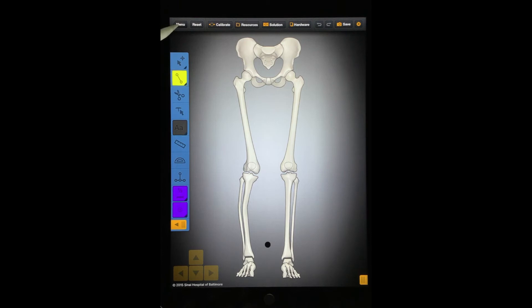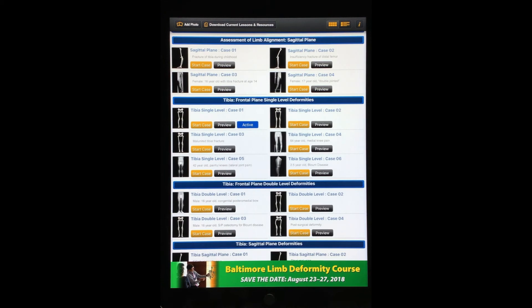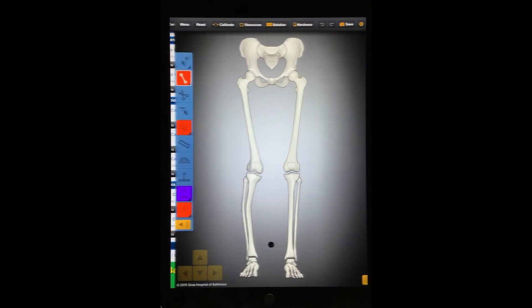Press the Menu button to return to the main menu. Save your work before returning to the main menu. If you return to the main menu without saving your work, you will lose all your work.